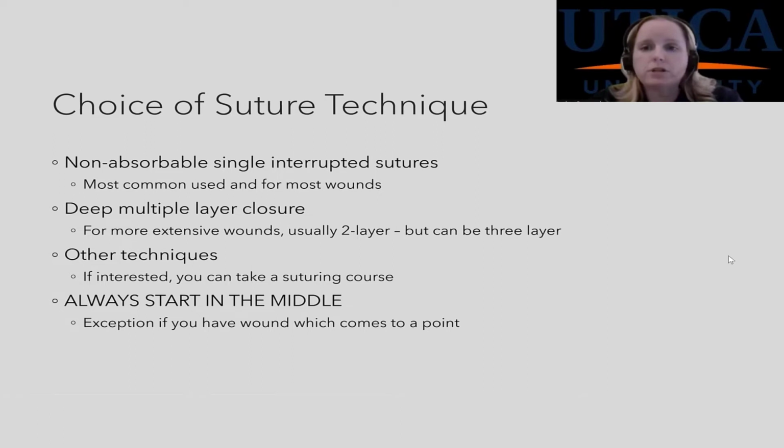So, choice of suture technique. This is what you're going to use 99% of the time: a non-absorbable single interrupted suture. That's what you need to know how to do. If you can do that, that's it. Unless you're going to work in surgery, you really don't need to know how to do anything else. It's the most commonly used, and you can use it for pretty much anything.